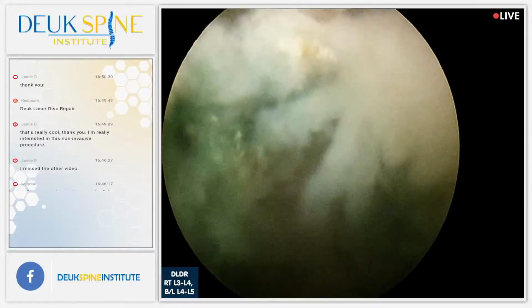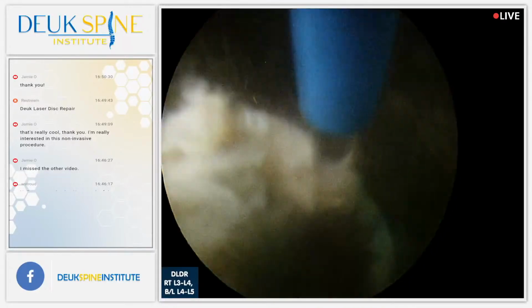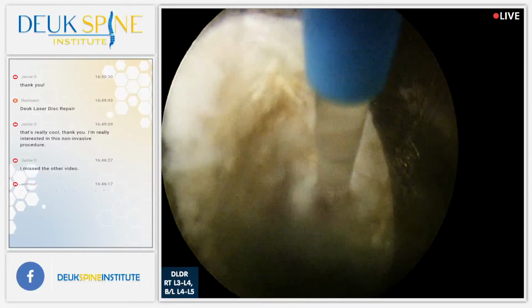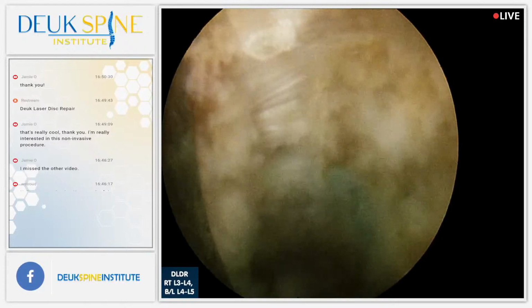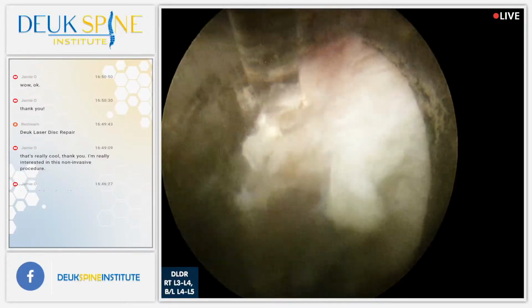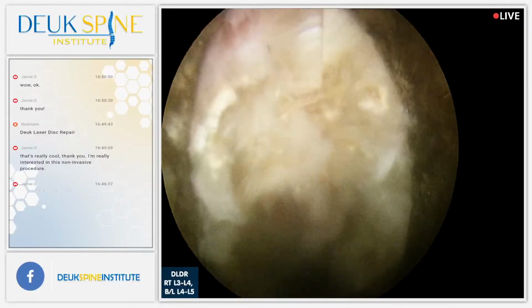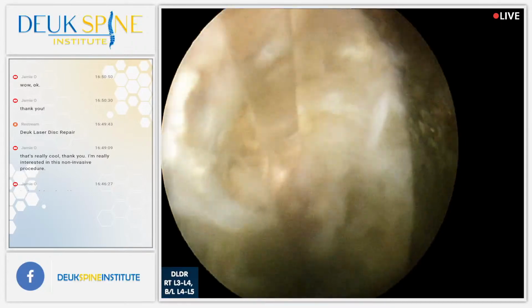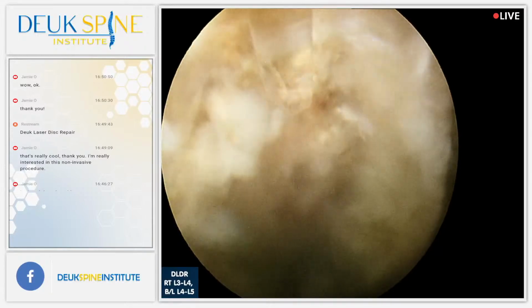It's not a liquid. A lot of people think it's liquid. It's not. More gelatinous, right? It's not even a jelly. It's firm. It's actually firm like a shrimp's uncooked body or a piece of uncooked lobster. That's how firm it is. You can see all the fibers right there. That's the annulus wall that was torn. And this is the top of the tear right here. This is the last part, and I'm cleaning this tear. Now, you can see all the fibers in there, right? That's because this is all scarred up from inflammation caused by the herniation in the tear.